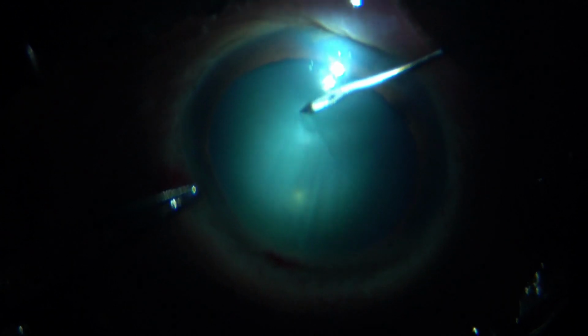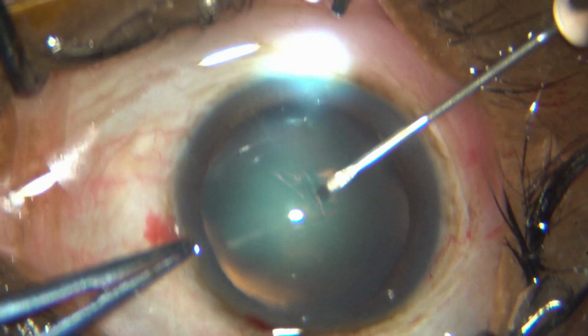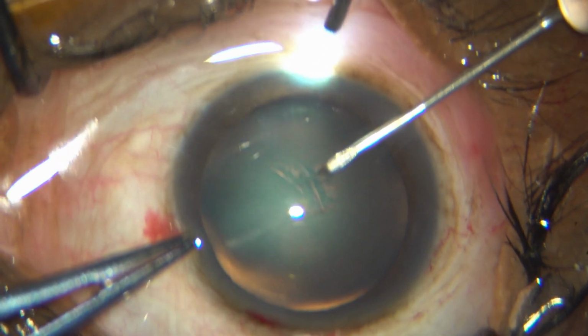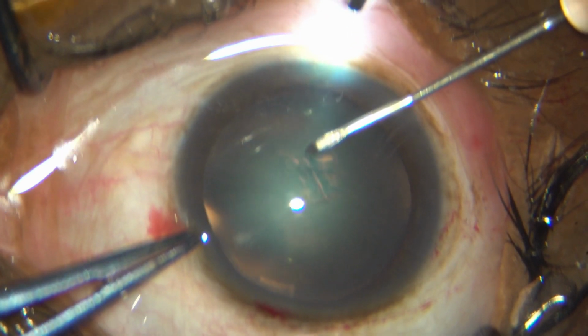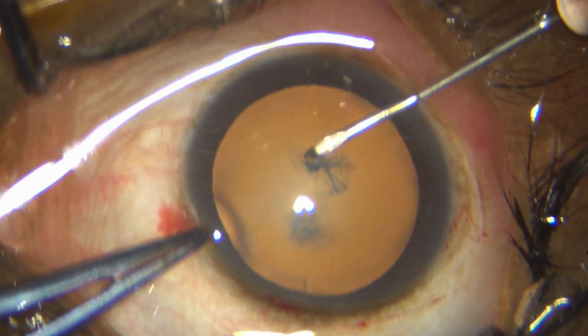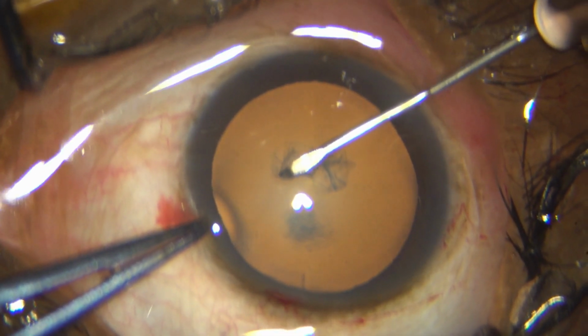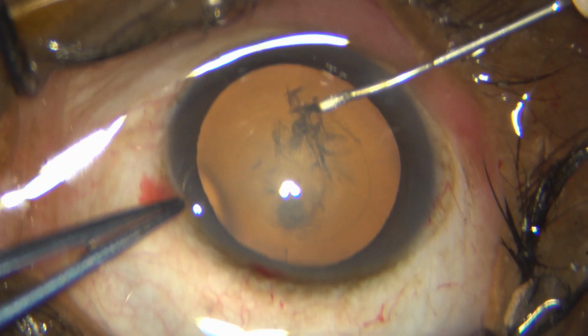I can see the flap, but since this is my first case, I did not want to go ahead with this. I switched on the microscope light and completed my rexis. However, it's anything but curvilinear. It ended up being pear-shaped. That was the rexis I had to work with, and I worked with that. So you can say the rexis is a bit out of shape, but no loss in integrity.